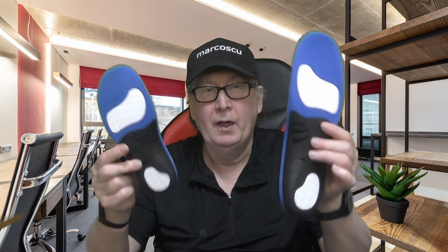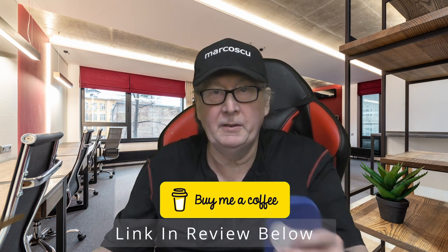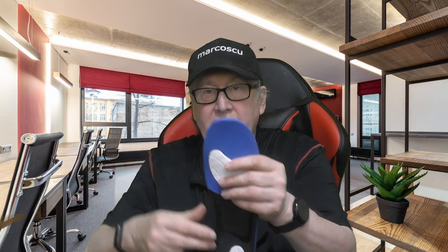The insoles are available in a range of sizes and can be custom fitted to any shoe size by simply trimming along the toe and side area to get them to size.